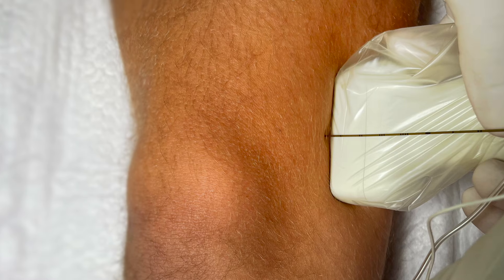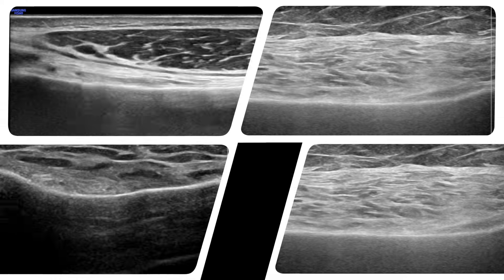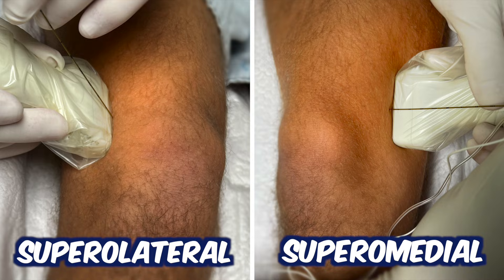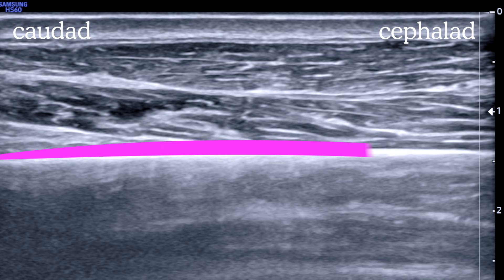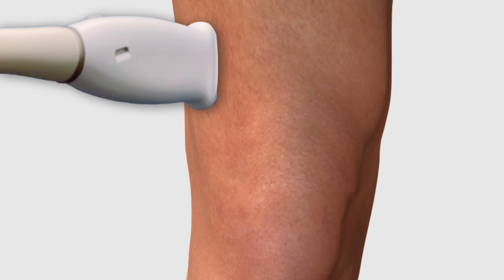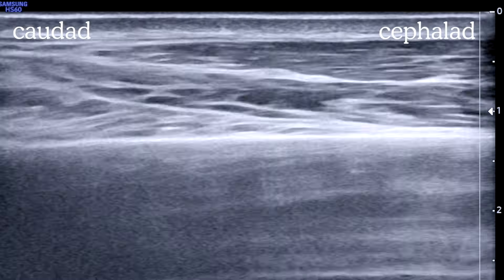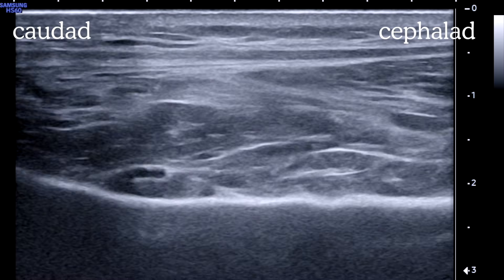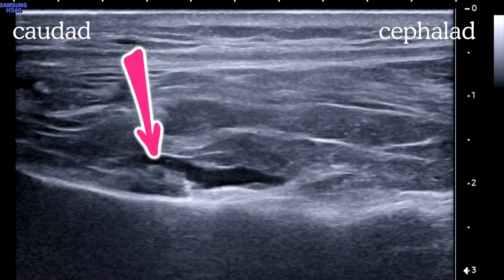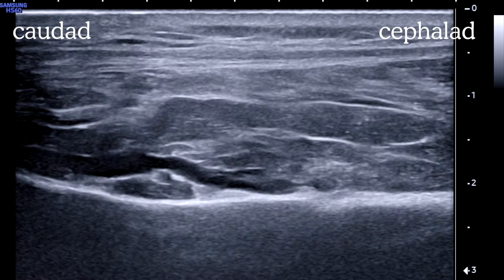The genicular nerve block technique involves using ultrasound to visualize the bony anatomy of the knee joint and then depositing local anesthetic at each location. For the two superior nerves, the probe is parasagittal and angled at 30 to 45 degrees, catching the anterolateral and anteromedial femur — kind of like the 10 and 2 o'clock of the steering wheel. You're looking for the bright hyperechoic line of the femur, then moving the probe distally toward the joint until you see the femur flaring up to become the epicondyle. As a reality check, the superior edge of the patella should line up with the exact center of your probe. Another useful landmark is the small genicular artery that can often be seen right where the femur starts to slope up, although it's not always visible.